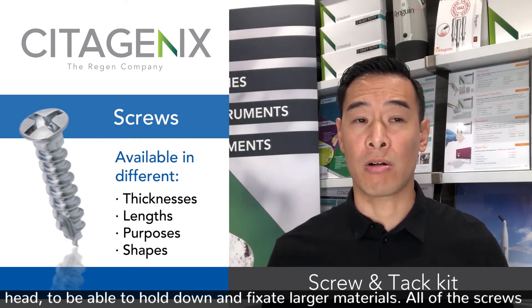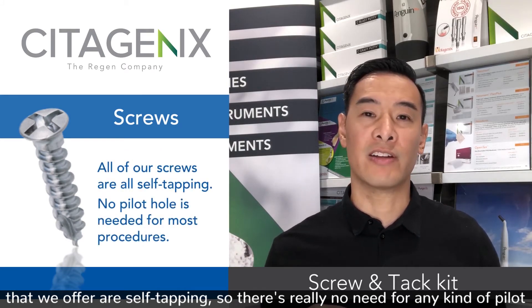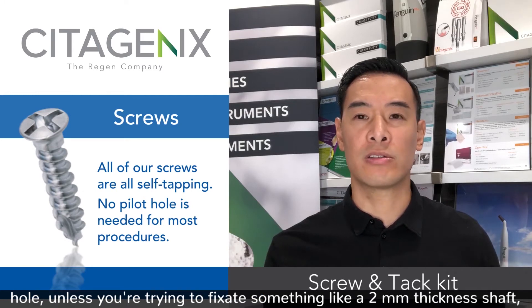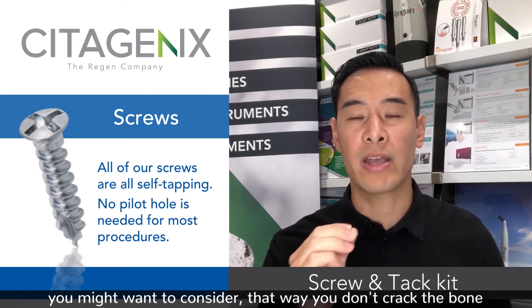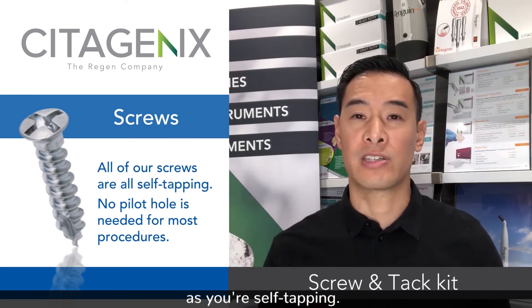All of the screws we offer are self-tapping, so there's really no need for any kind of pilot hole — unless you're using a 2 millimeter thickness shaft, in which case you might want to consider a pilot hole so you don't crack the bone as you're self-tapping.